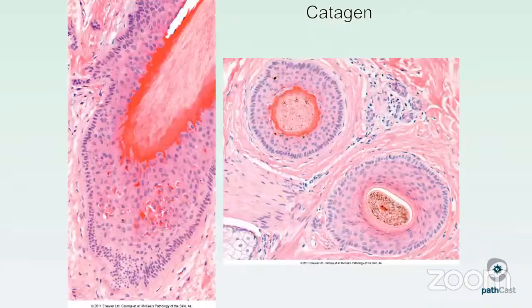The club hair being the telogen hair at the end of that is ready to actually be shed from the scalp. So this is what it actually looks like in the tissue. In catagen, we are seeing that disintegration happening to the lower segment, where instead of our matrical cells being nice and blue, they're starting to have this degenerative change, lots of apoptosis all over the place, dyskeratotic cells. And then this really bright pink orange keratinization towards the hair shaft as it's forming that flamethrower-like appearance that will be the end stage of this, the telogen hair that is ready to be shed.